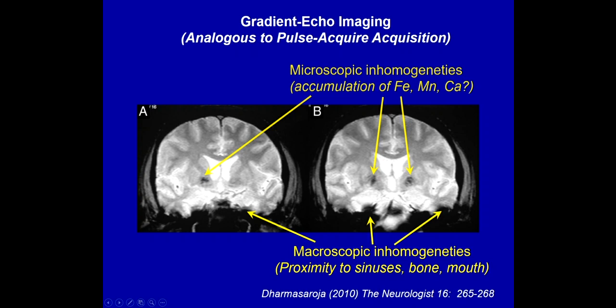It's very slight. It's enough that if you just look at an image when someone's in a stimulated state, you are very unlikely to see it. But if you do a pixel by pixel comparison across a series of images, then it can become apparent if the stimulation is strong enough. So that's an example of why T2 star can be a beneficial thing.